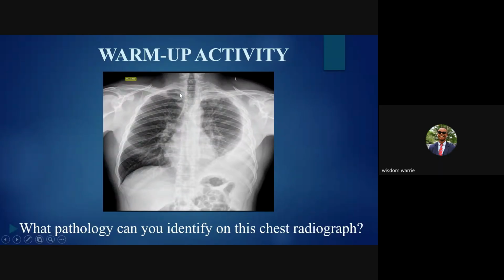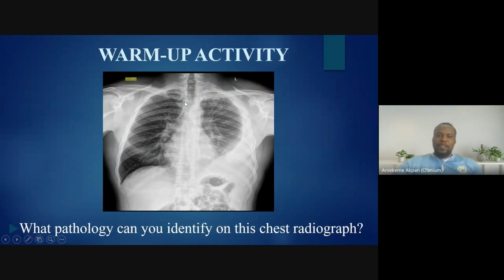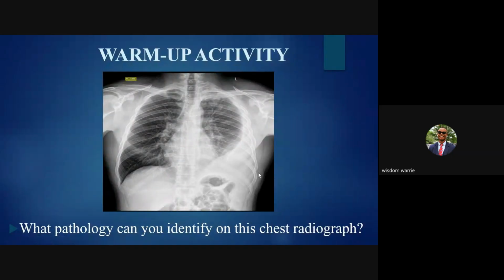Mania Kanabasi, please unmute yourself and speak. Okay, good evening all. I agree with what the first person said. I think it is pleural effusion on the left side. Yes. All right. Do we have any other person that also wants to speak? Or that's all? No, that's all.